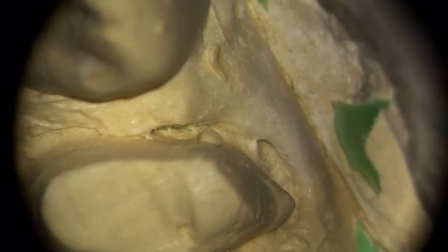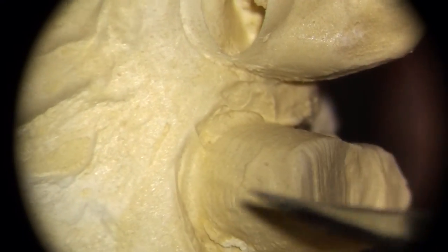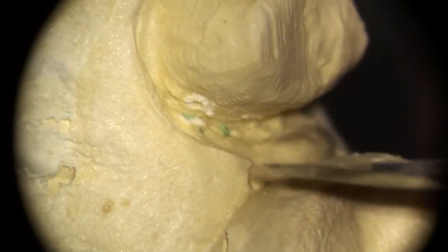Increase our lighting here a little bit, and higher magnification, and we can see, not going to be quite as much fun as we hoped when we woke up this morning. So you see some contamination here, probably not gum tissue pulled over there, but probably some moisture stayed in there. Over here where it's rough is probably just insufficient rinsing of the tooth before they took the impression. So that's what that little bubbly roughness looks like.